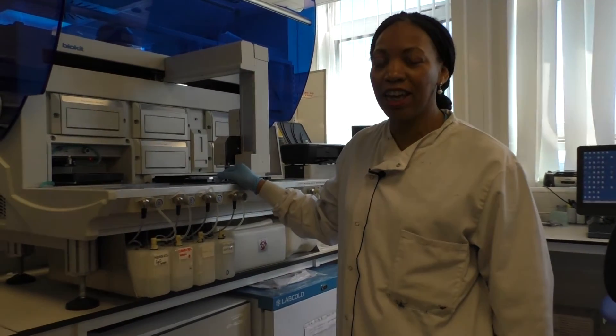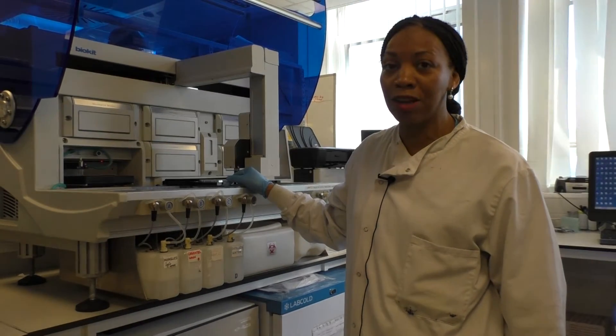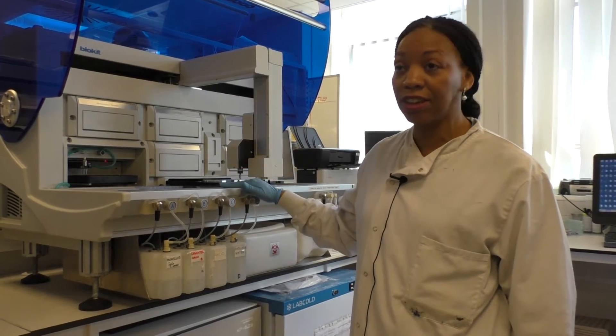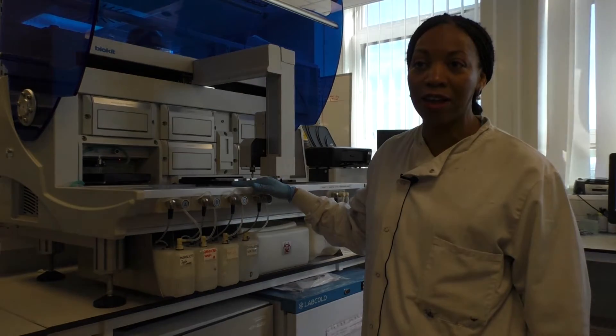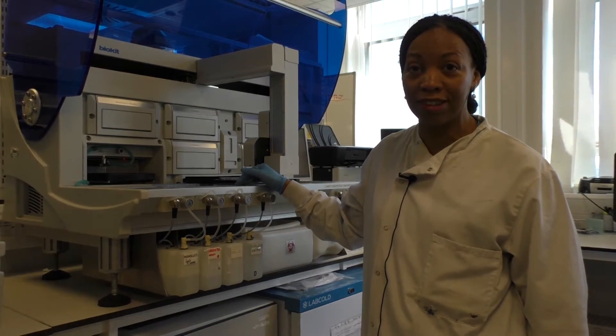The technique we're using here is an ELISA technique, which is an enzyme-linked immunosorbent assay. We're using this analyzer to measure tissue transglutaminase antibodies, which are primarily found in patients with celiac disease.